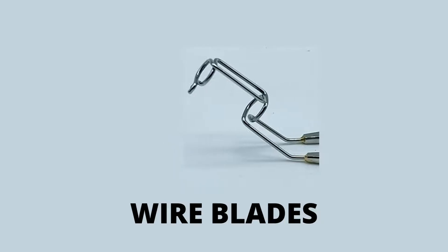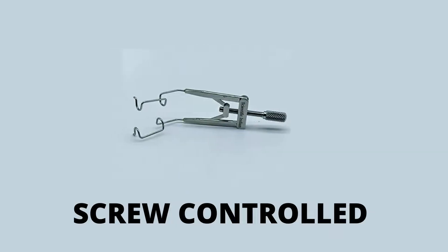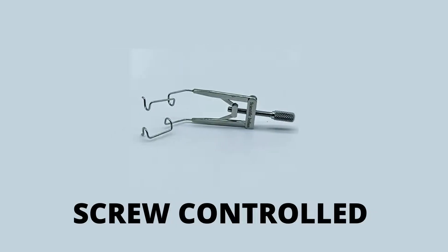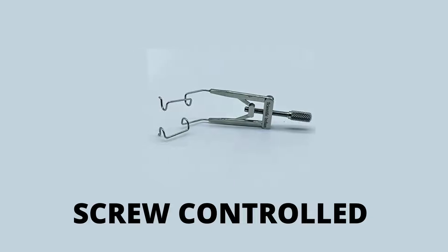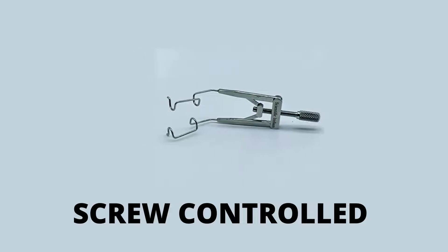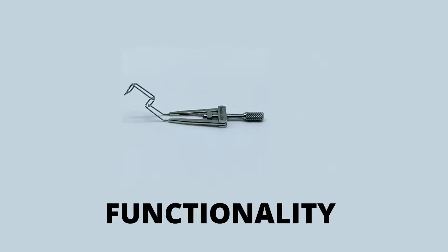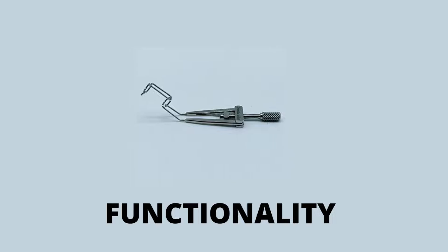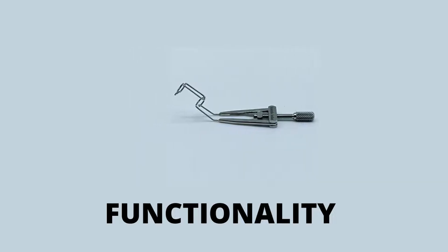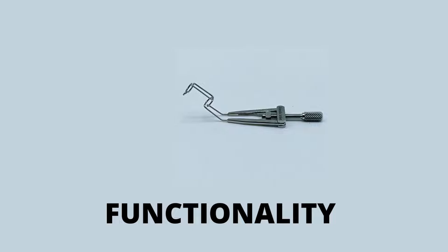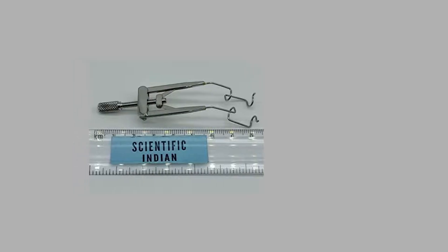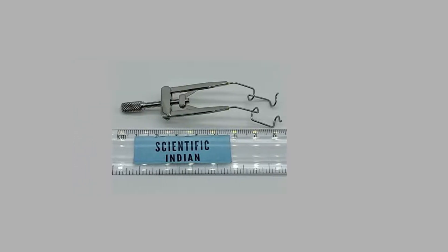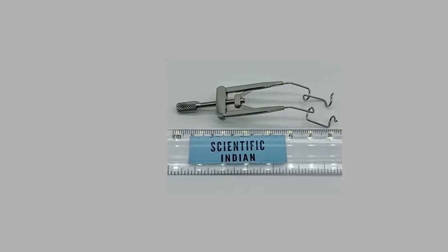It features a screw mechanism that offers better control in opening the eye speculum during surgery. The angled blade reduces interruption of the operating eye field. The speculum helps in varying the exposure of the operating field and changing pressure on the globe during surgery.